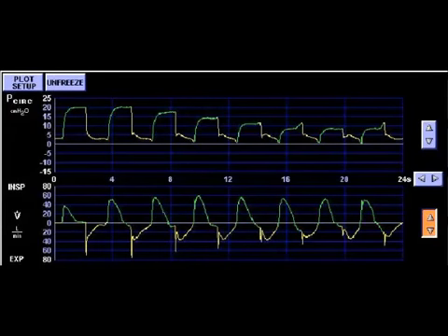Okay, here's a screenshot of adaptive pressure control ventilation. We're looking at the last videos of pressure control, and someone might say, well, instead of having these high tidal volumes, and we want to give the advantages of unlimited flow to the patient, why don't we just put it on adaptive pressure control? Then I can target a tidal volume and have less tidal volume variance, and then the patient can get all the flow they want. So this might seem like a good idea, however, it's actually a very bad idea.